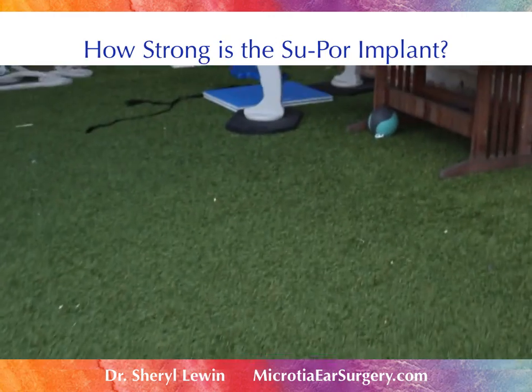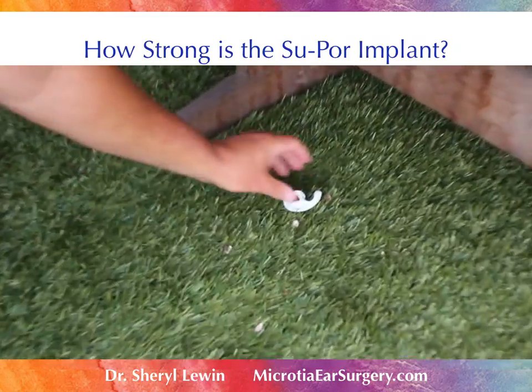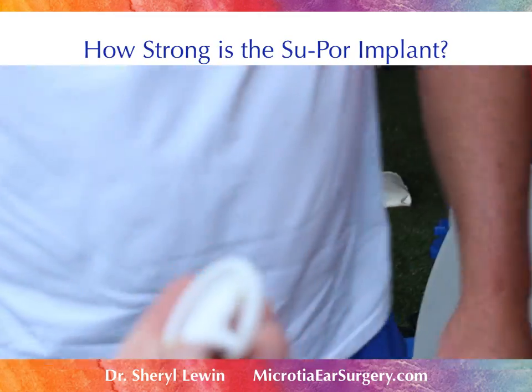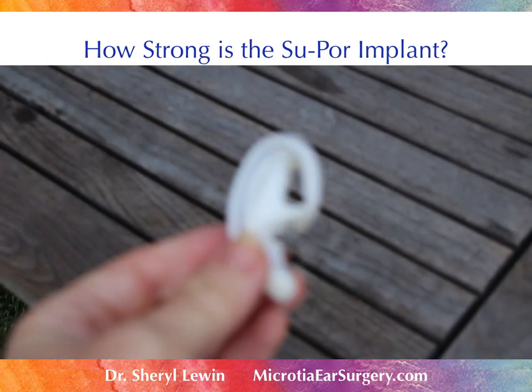Where is it? Oh, that's okay — I see it. Alright. There it goes. Let's look at the damage — and it looks like it is completely intact.